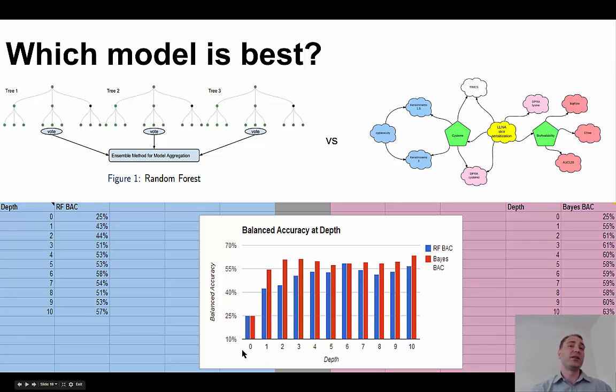You can then see after we've done one test, which would be the most valuable test globally speaking, that both of these models have a substantial improvement in accuracy. And then as we do more tests, accuracy goes up for a while, particularly in the random forest, but then it seems to level out. And so that would indicate to us that our algorithm seems to be doing a good job of providing the most valuable next test, and that at some point we could probably stop doing testing.